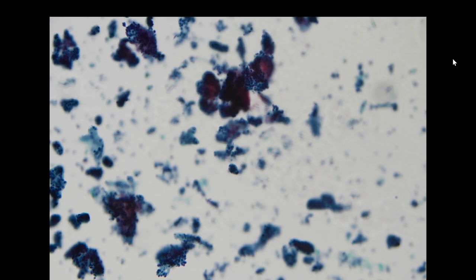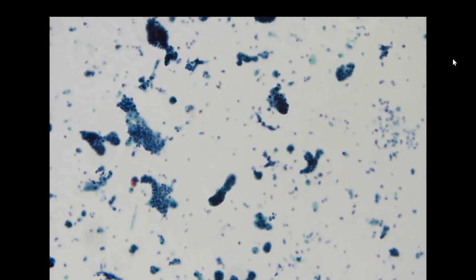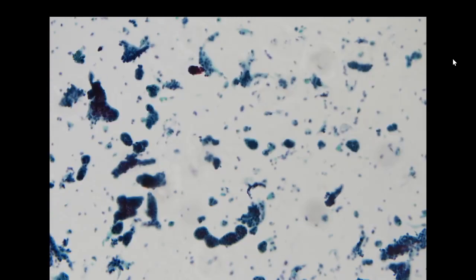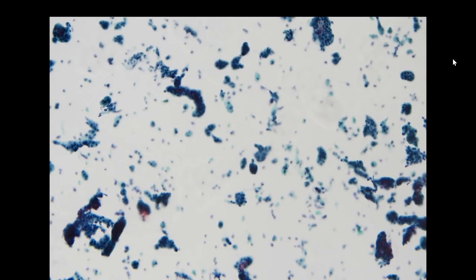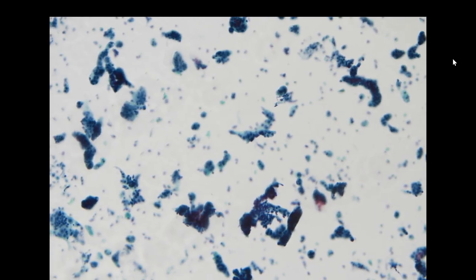But because our tag already says there's no tissue, I was a little hesitant whether we should do a cell block or just do a direct cytospin for the immunohistochemistry. For this case, I think maybe we just do a cytospin, because I don't want to do a cell block and there's nothing there, and then we miss the chance to help this elderly lady.